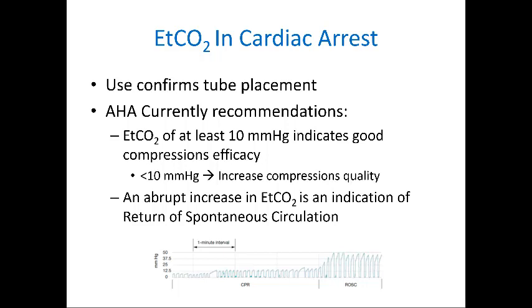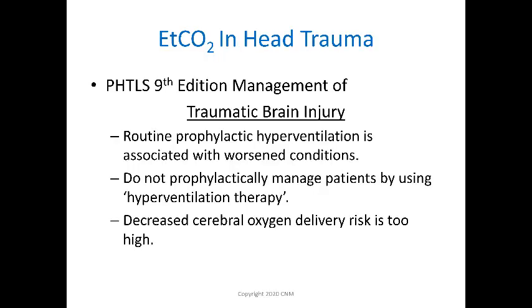End-tidal CO2 can also be useful when managing patients in trauma, not just as a diagnostic tool, but also as a means of trying to get some treatment. Now, the first idea here, though, is that this is not for all traumatic brain injuries. Instead, we're really wanting to limit it to if the patient has a traumatic brain injury that's not herniating, right? And we'll talk about those signs in just a minute. Those patients should not be treated with routine prophylactic hyperventilation or attempts to change their end-tidal CO2.